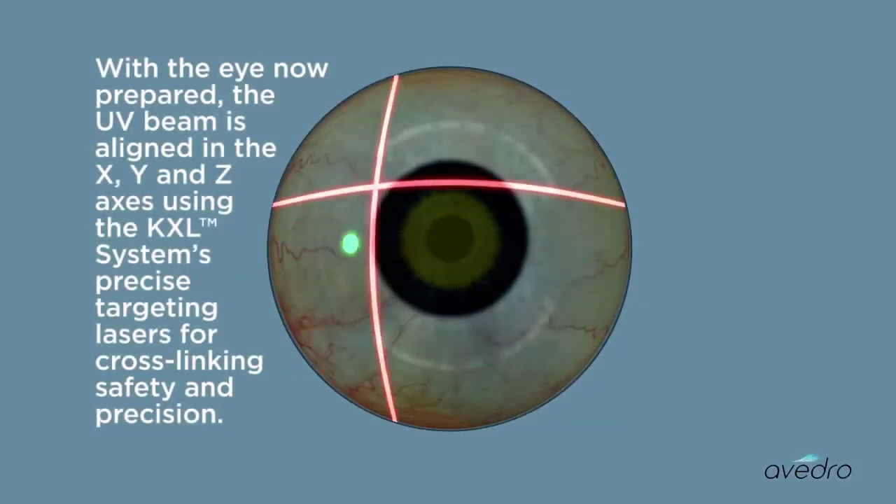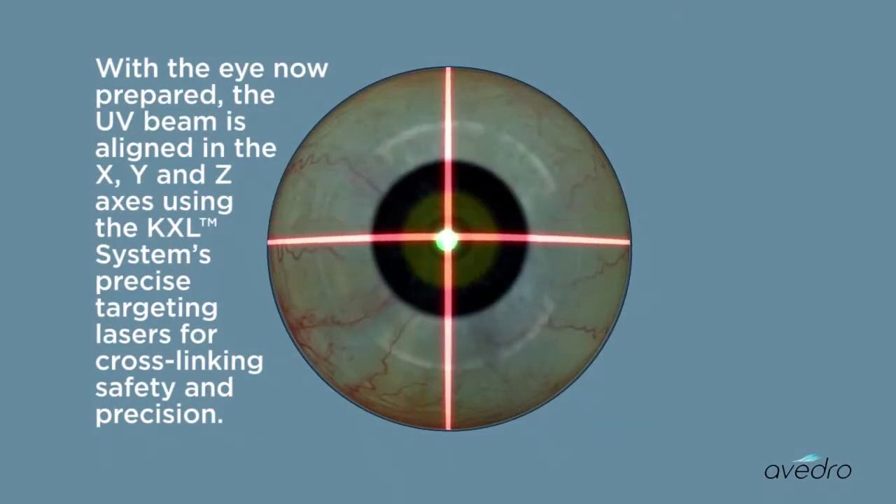the UV beam is aligned in the X, Y, and Z axes using the KXL system's precise targeting lasers for cross-linking safety and precision.